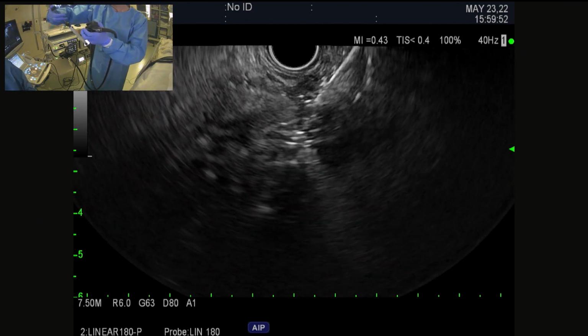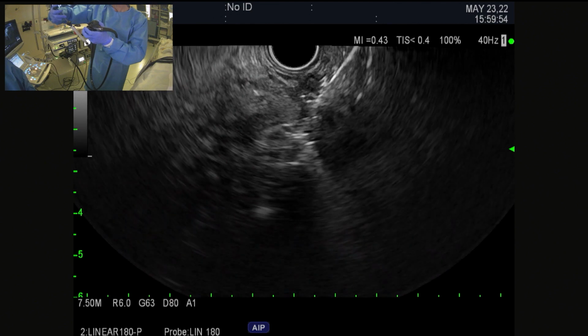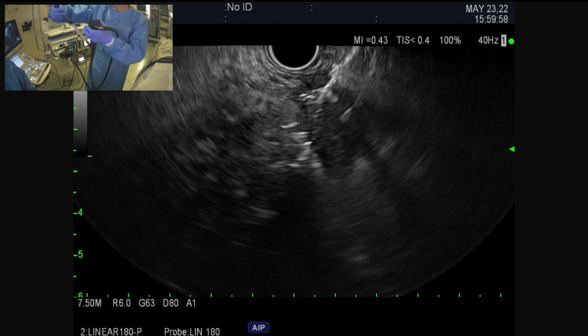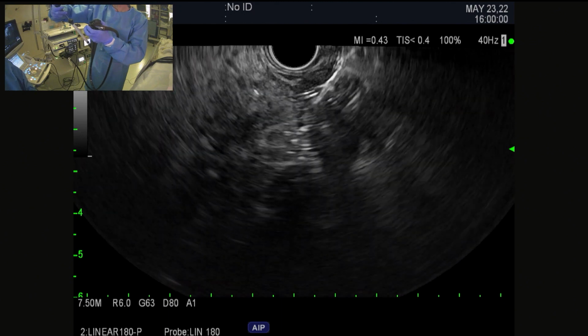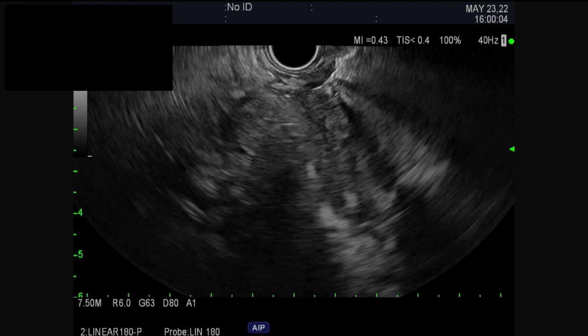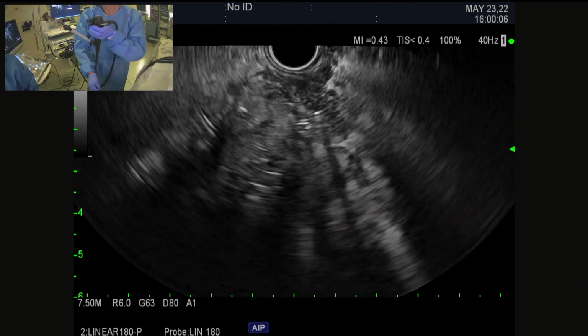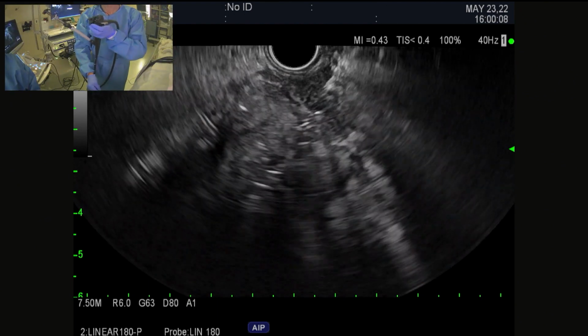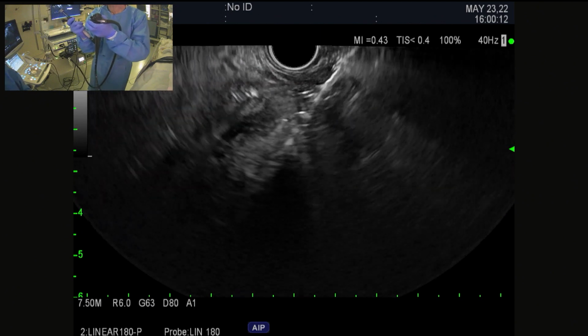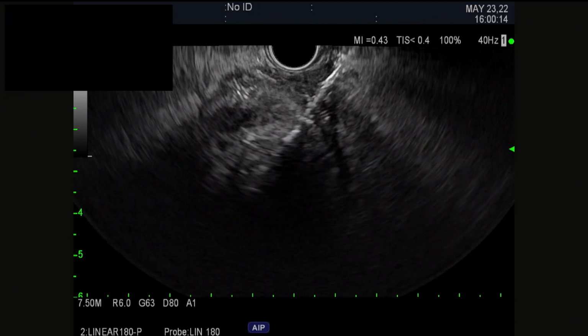And I'm doing it very slowly, very slowly. And this is the part that you may not see so well. All right, so I'm still pulling, and I'm going to wait till it clicks. And it just clicked. Now, indeed, I don't see the flange so well. And Todd, this is exactly the problem when you have a lot of necrosis. So I'm going to start snugging up. I'm pulling back.